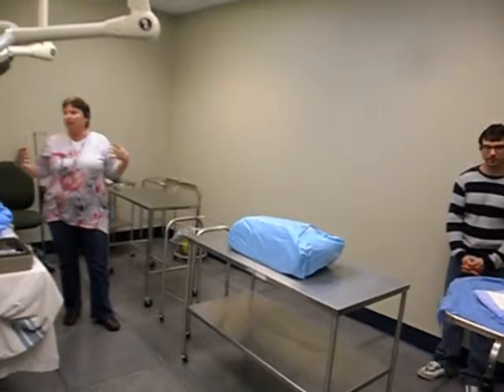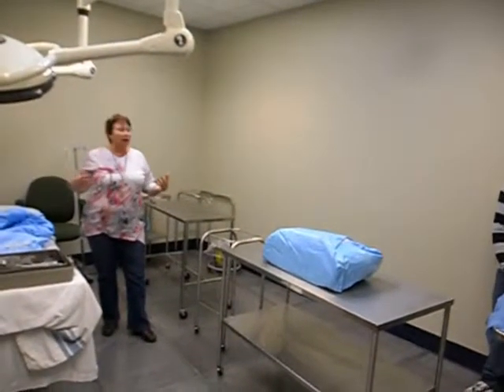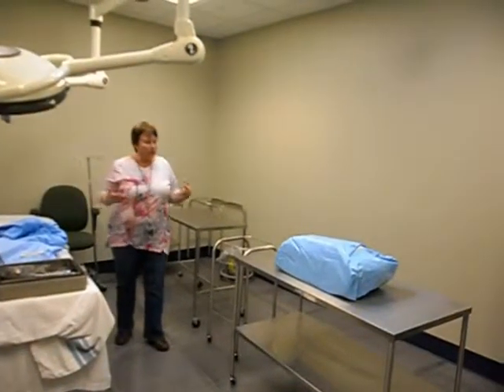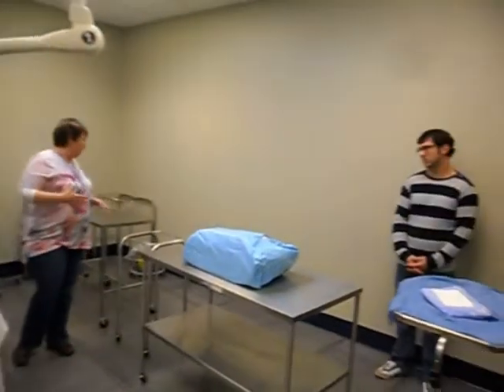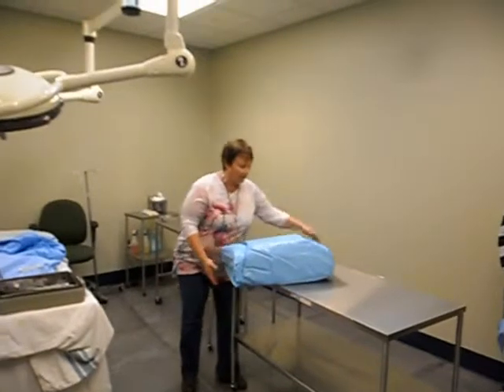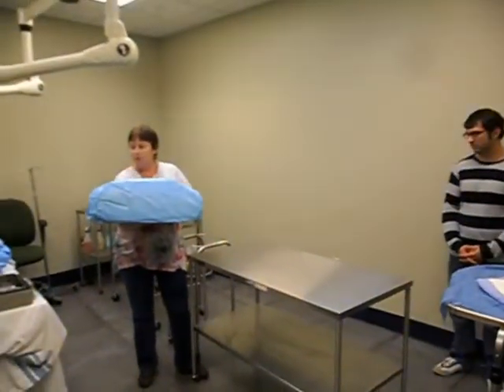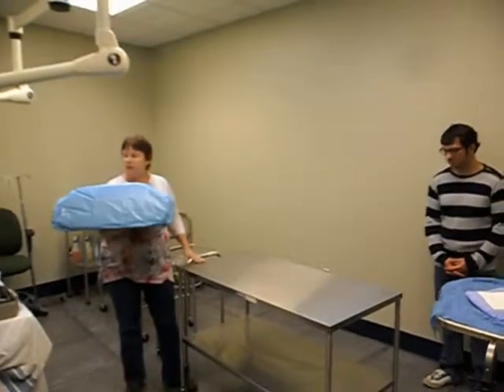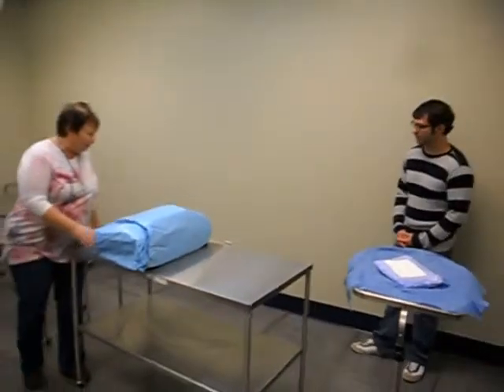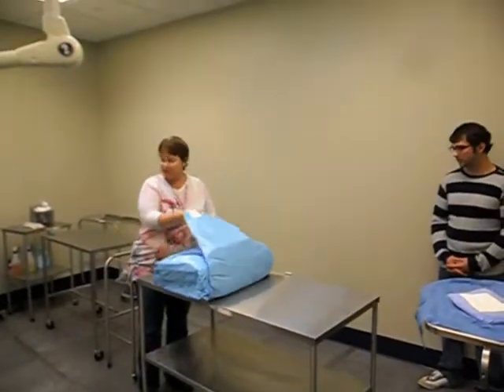Another thing is we would need a custom pack that would be something more of a major pack, and so all we have is an arthroscopy. So Joel's gonna have to improvise and make do with that. Now, I'll be his RN and I'm gonna be the doctor too, I'm a jack of all, I guess. With that said, I would have checked for holes in my package, checked for expiration date, and this table I would wanna make sure would be dry. And now I'm gonna open this pack up, and Joel can help me because he hasn't scrubbed in yet.